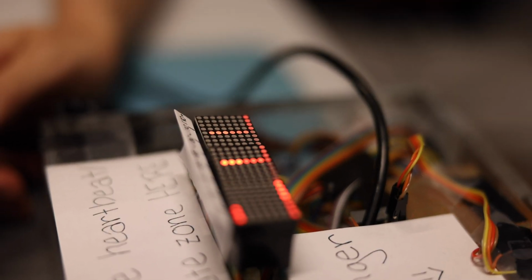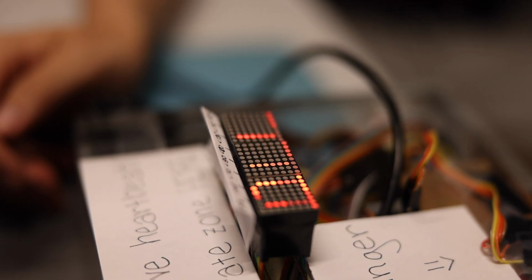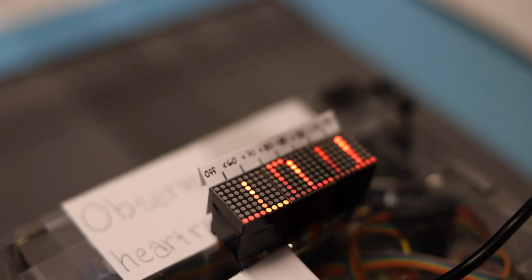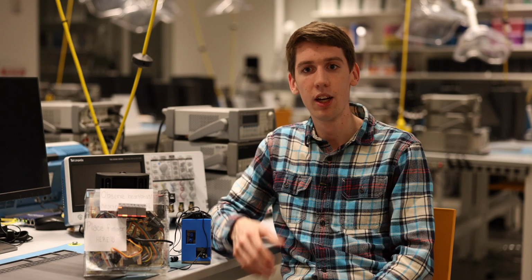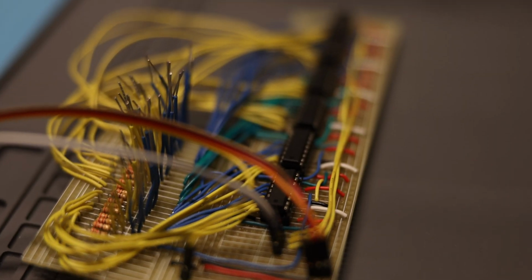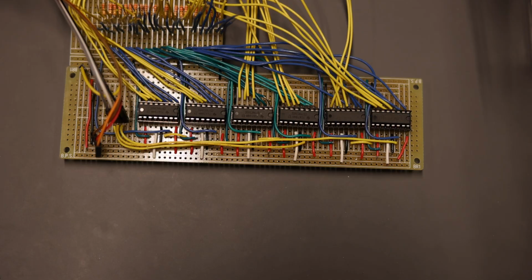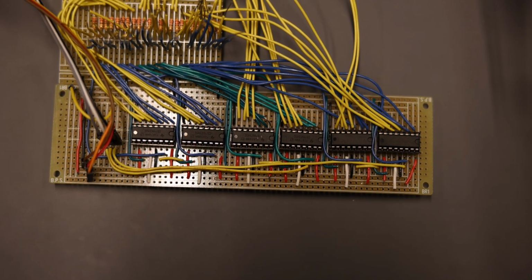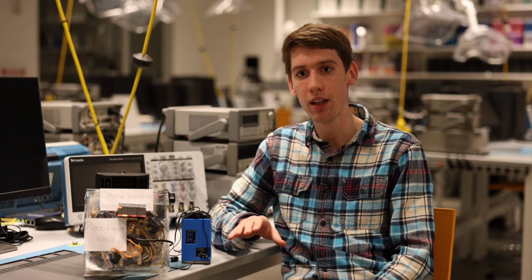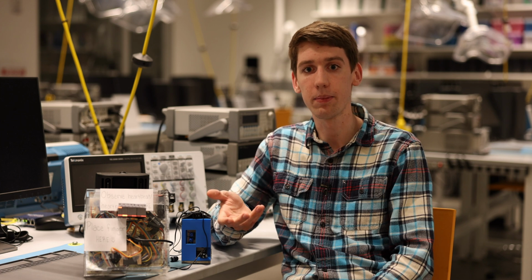On the display, we have 4 seconds of real-time heartbeats displayed. The top row of LEDs is reserved for displaying an approximate heart rate zone, which is calculated every 10 seconds. We decided to use shift registers to divide the signal output from the Arduino. The shift registers turn a single input into 8 outputs that update based on a latch signal. Since we want to update all of the LEDs at the same time, all of the shift registers can share the same latch as well as clock signal.